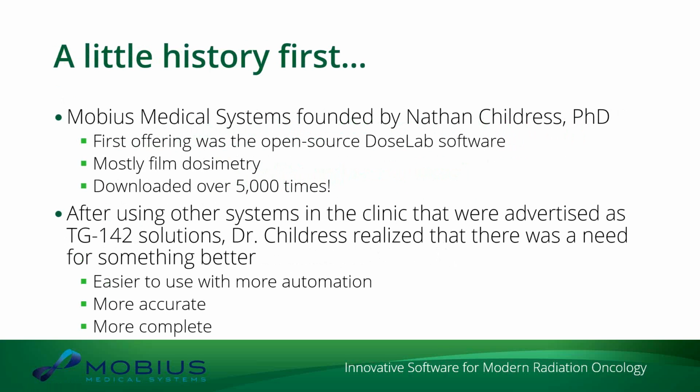And so while Dr. Childress was in the clinic, and they started to work on following the TG-142 recommendations, he was trying to use some of the other solutions that were out there that had been advertised as a TG-142 solution, and he realized pretty quickly that there was a need for something better.